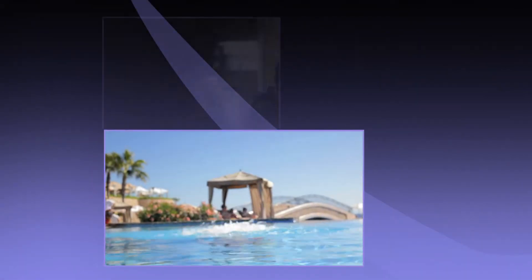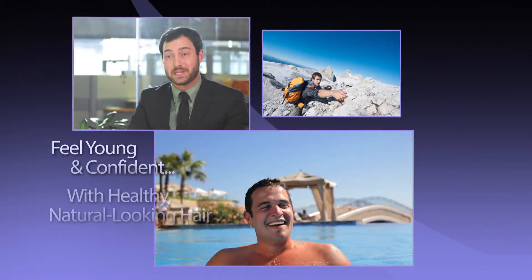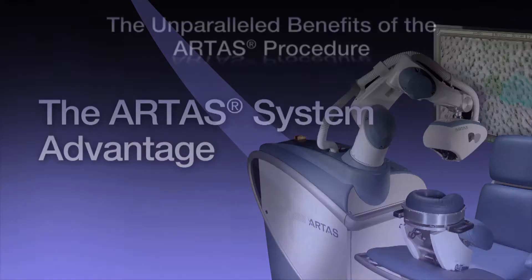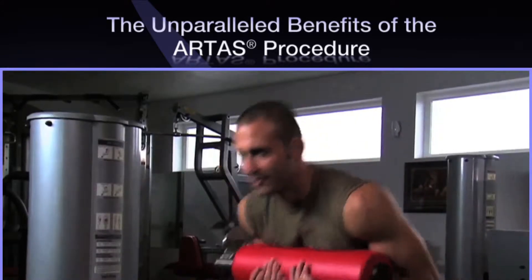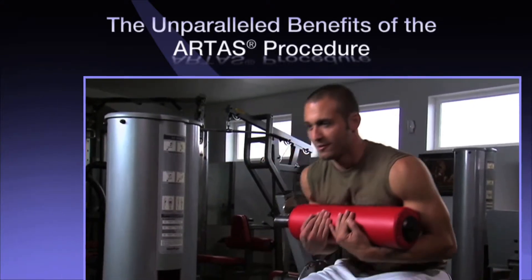The ARTAS system utilizes the latest digital imaging technology and precision robotics to help you keep that youthful and confident feeling with healthy, natural results. The ARTAS system is the first and only FDA-cleared computer-assisted technology for harvesting follicular units directly from your donor area.